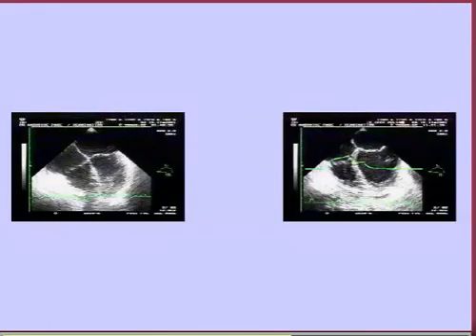And we observe this situation in many patients, but look at an example in this patient, hospitalized for a septic shock from a urinary origin. And look at baseline before infusing norepinephrine. You can see a hyperkinetic state. Look at how well the left ventricle is working, and what happened a few hours later after infusing the norepinephrine and restoring a normal afterload.